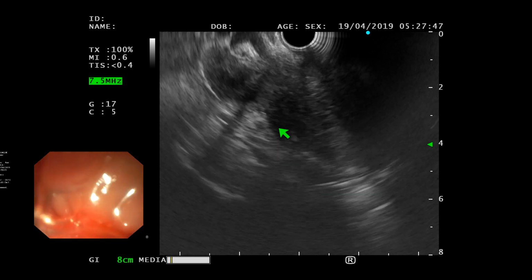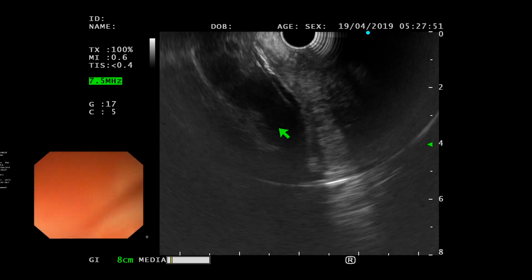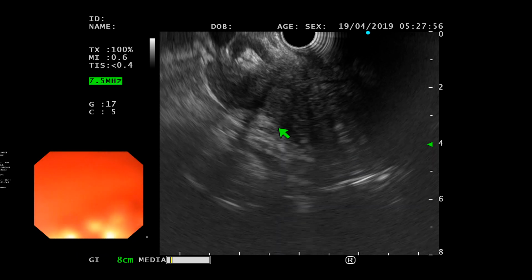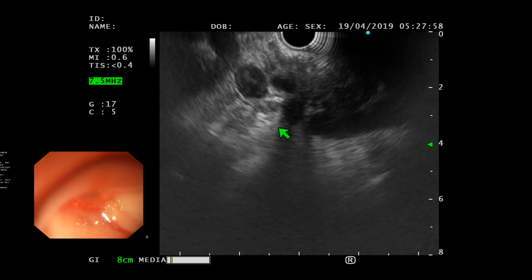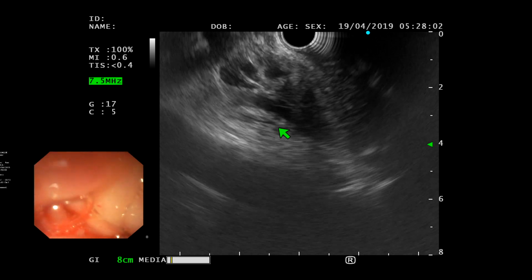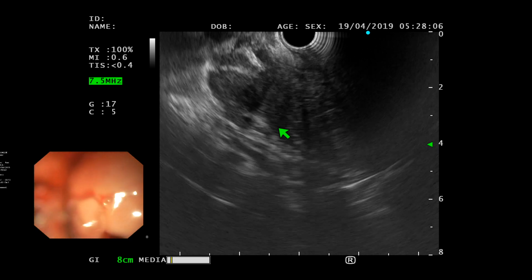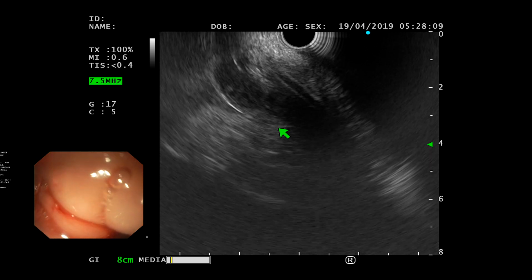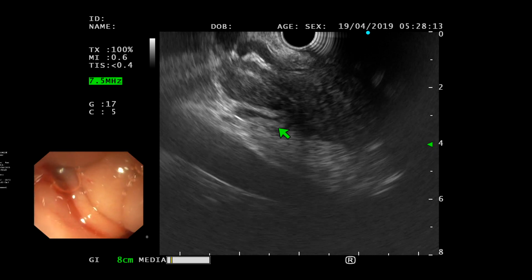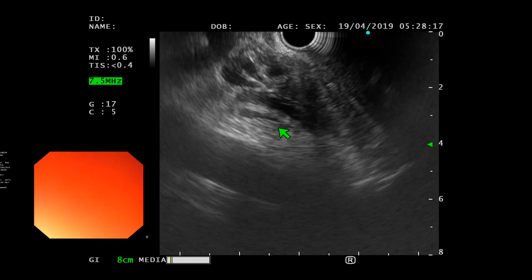I'm actually inclined to biopsy this mass really, because I don't think I'll be pushing into D2, guys. You can see that I can't. I'm in the bulb, and you can see the whole D2 closes on me. So I have no real intentions to push it through on the poor girl, and I think I'll probably. Please give me the needle. Needle please. So would you do, like, dilatation of D2, ma'am?